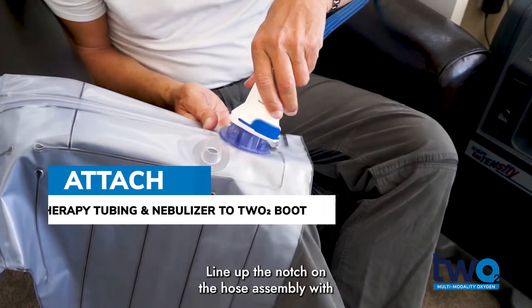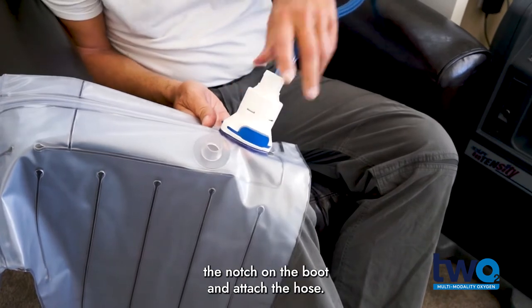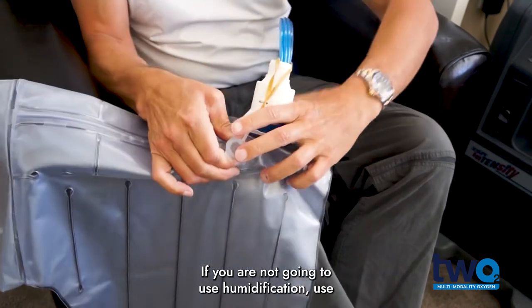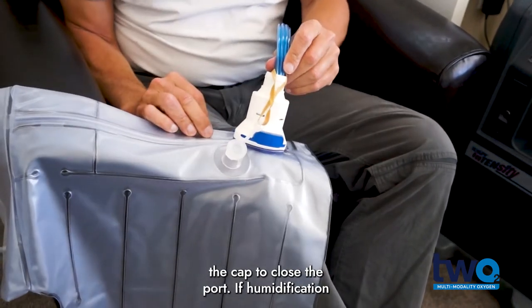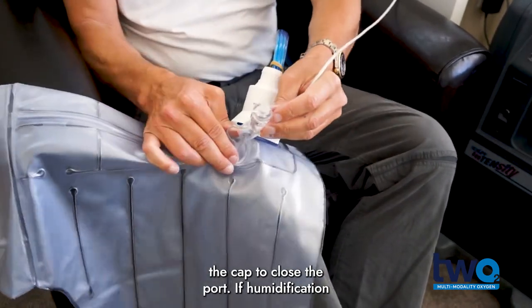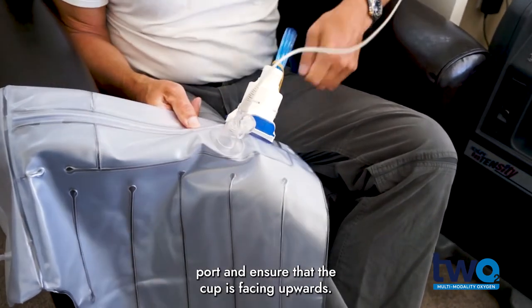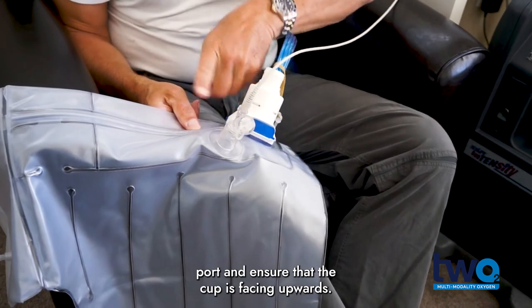Line up the notch on the hose assembly with the notch on the boot and attach the hose. If you are not going to use humidification, use the cap to close the port. If humidification is used, attach the nebulizer cup to the port and ensure that the cup is facing upwards.